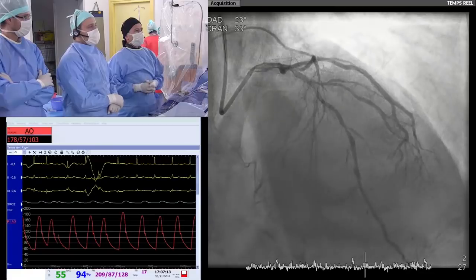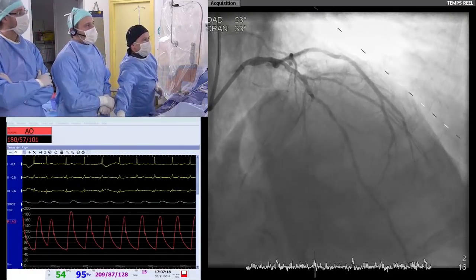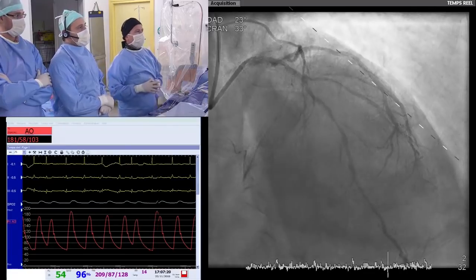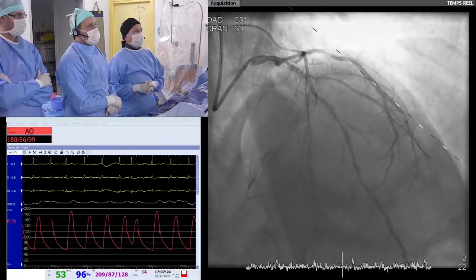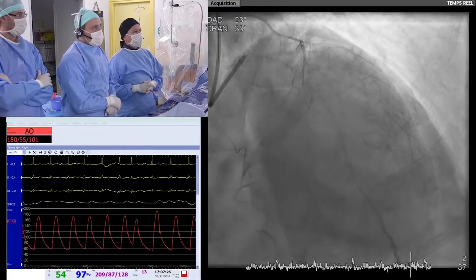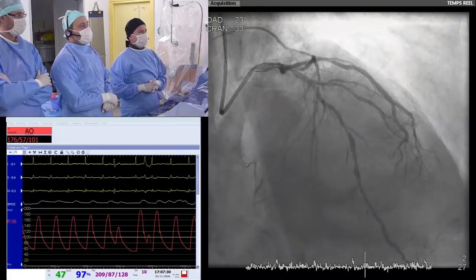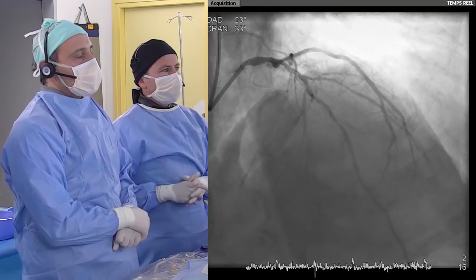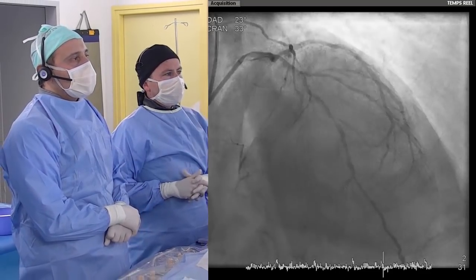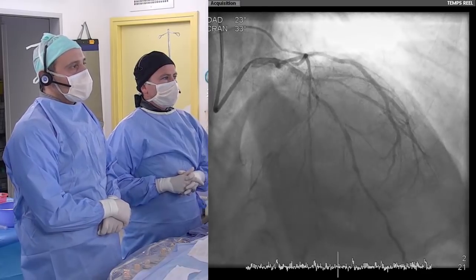With an empty coronary artery, at the beginning of the injection, you can appreciate already at the fluoroscopy the amount of calcium that is present in this vessel, from top to toe actually. And you can also understand what could be the issue behind this damping of pressure. There is indeed an ostial left main stenosis there that was not at all looked into at the time of the diagnostic procedure.